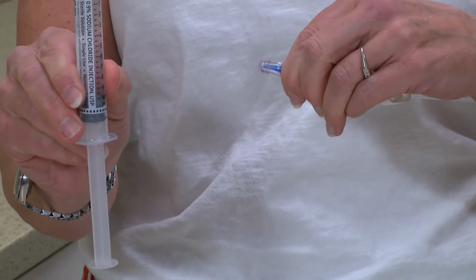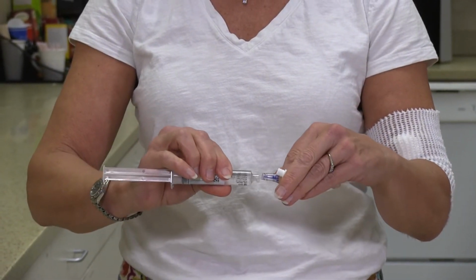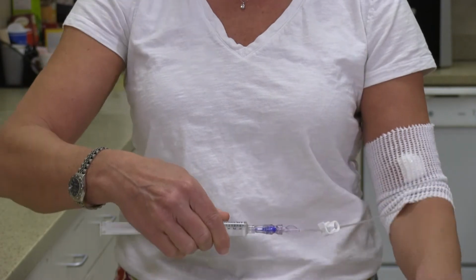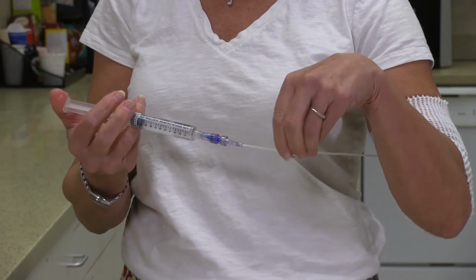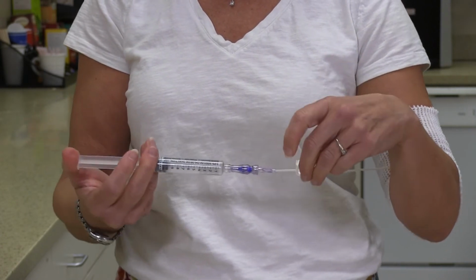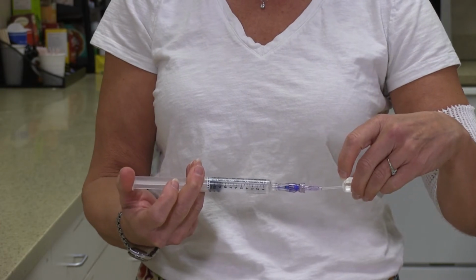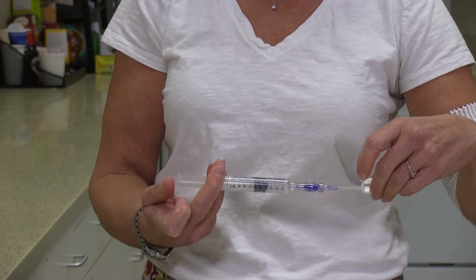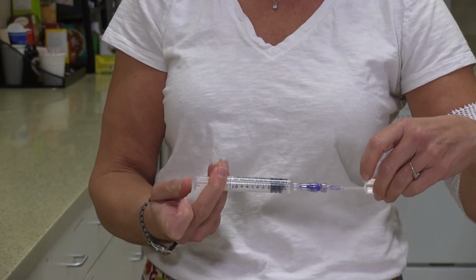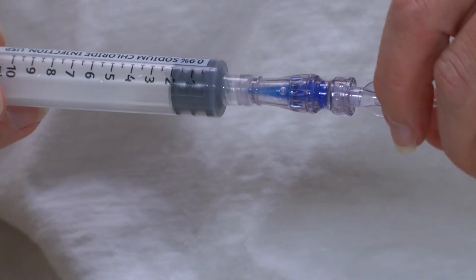Now, remove the cap from the end of the first saline syringe and attach it to your injection cap by pushing and twisting until it is firmly in place. Unclamp your catheter. Push the plunger on the saline syringe slowly, or you can use the pulse method to flush the catheter. To use the pulse method, push the plunger, pause, and then push and pause again until the syringe is empty. Do not force the flush. If you have resistance, contact your pharmacy.